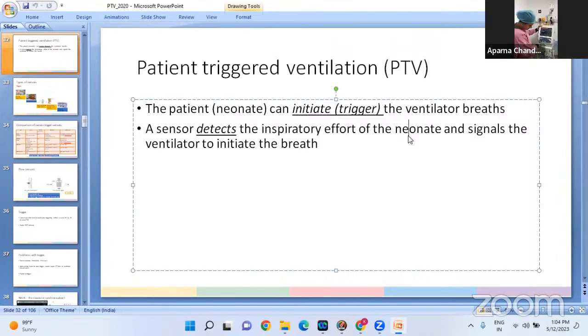So the heart of the ventilator comprises the gas source. Then we have the actual patient, the ventilator's interface. We have the inspiratory tubing and the expiratory tubing, and the patient interface, which is the endotracheal tube. So let's go part by part.